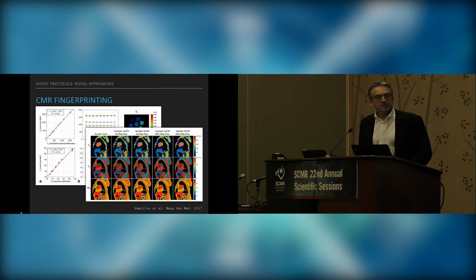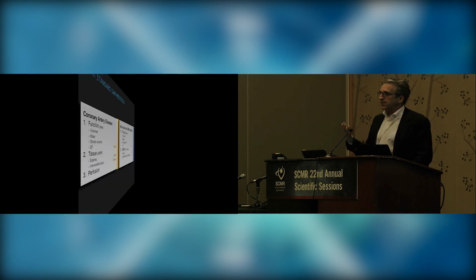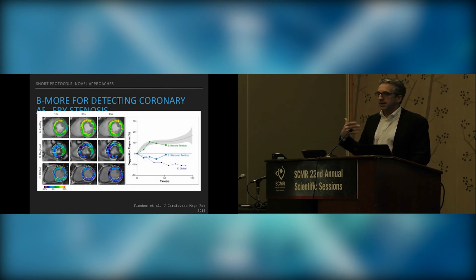Another factor, and this is just because I'm very enthusiastic about that, so take this with a grain of salt and bias here. As another example of how this may change in the future, we have, for years, validated and now are applying breathing maneuvers instead of adenosine as a vasoactive maneuver. Believe it or not, as you sit here, if you hyperventilate for a minute, your blood supply to the heart and the brain will decrease. You will feel maybe even a bit dizzy or panicky. And if you hold your breath, it's the opposite. Your blood supply increases. And you can actually demonstrate and track that with oxygenation-sensitive MR.